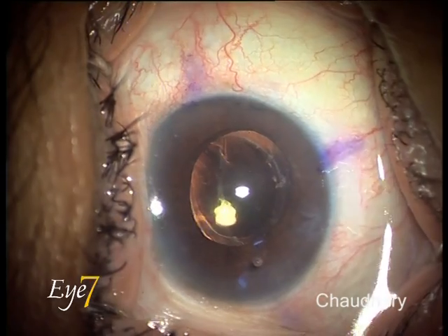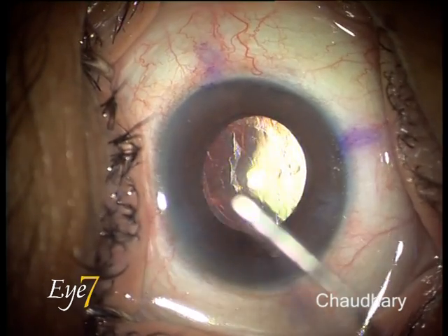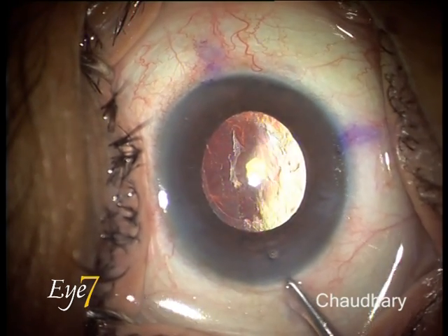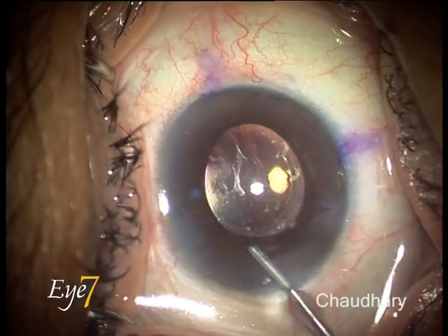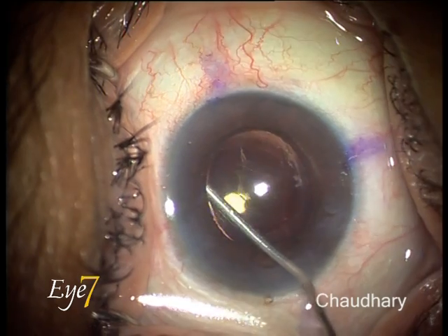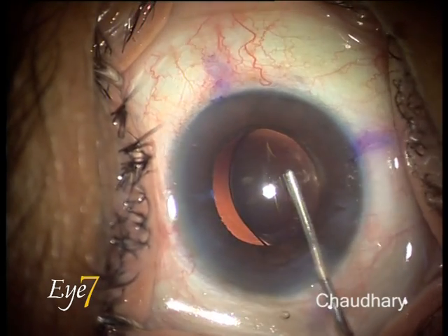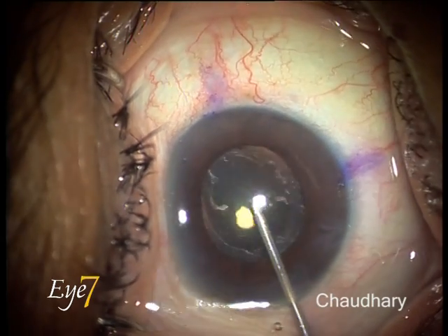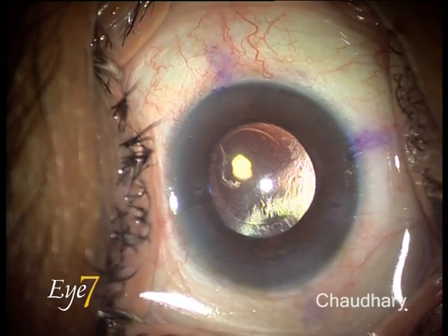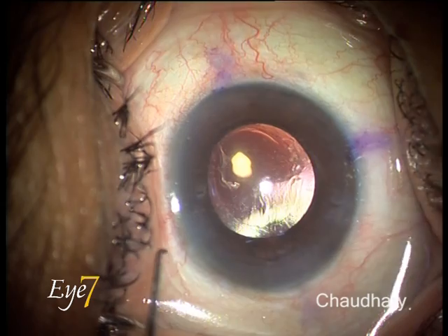We presume that this lens is adherent all over to the capsular bag and we will have to separate the entire lens from the capsular bag. Now I am moving with a viscoelastic under the anterior capsule, injecting the viscoelastic, and you can see this viscoelastic wave going behind the lens. With counter pressure, I complete the viscoelastic wave and I think I have a totally free lens in the capsular bag.